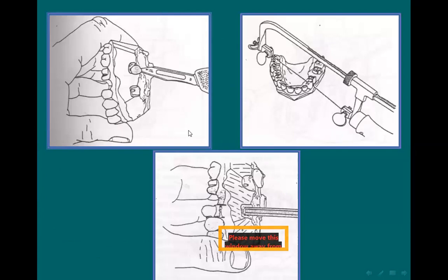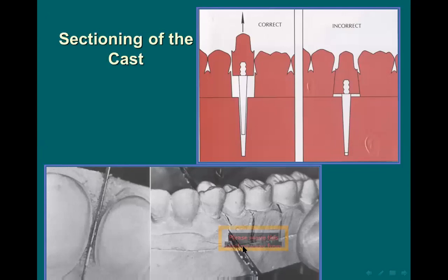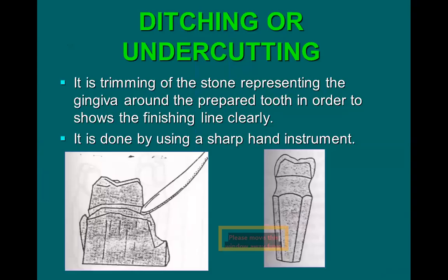بعد ذلك أسوي تريمينج، يعني عملية قطع للزيادات مال الكاست، وأبدي أسوي سكشنينج. السكشنينج هو عملية فصل الريموفبل داي من الكاست. القصة هنا مهمة جدا أنها تكون بصورة متوازية، القصتين اللي حول الريموفبل داي، من أجل أن يخرج من مكانه. إذا القصة ما صارت متوازية وصار بها ميلان أو كونفيرج، راح يصير عندي أندر كات وما يخرج الريموفبل داي من مكانه.